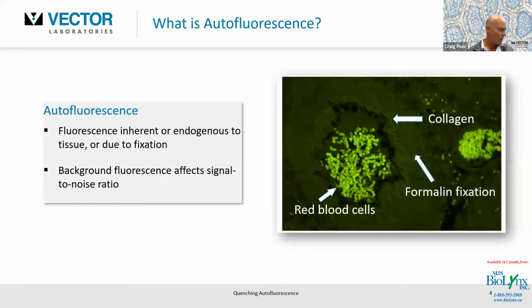And you can certainly see from this particular image on the right-hand side here, some of these red blood cells, highly fluorescent, formalin fixation contributing here in this arterial wall, and the collagens and elastins here also being particularly problematic. These are the main sources of autofluorescence and that are particularly problematic for a lot of investigators. And you can imagine if you were working in the green spectrum, if you had a GFP protein, for example, green fluorescent protein, or you were using a standard, say, fluorescein or an Alexa 488 or a DyLight 488, and trying to identify a marker here, you're going to have a lot of problems in trying to identify what is specific from that background autofluorescence.